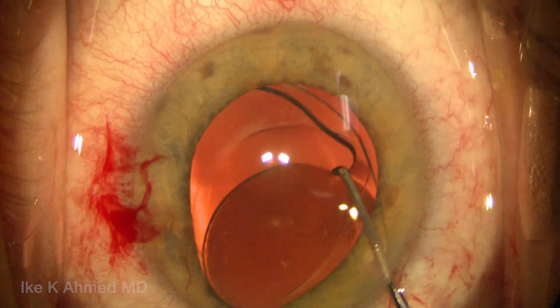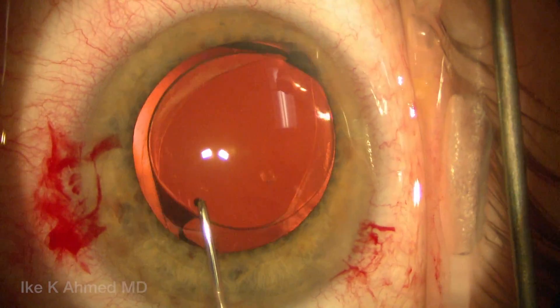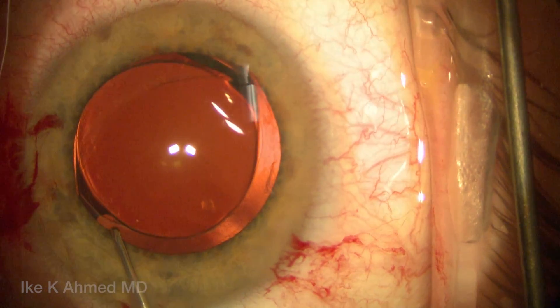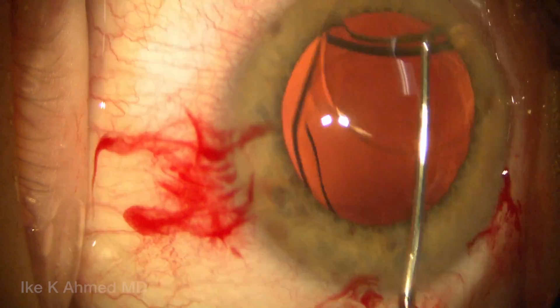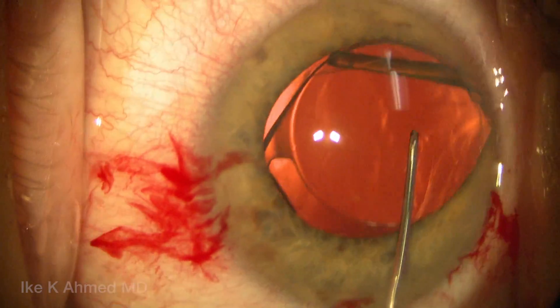We now use the Sinskey — the haptic is freed up quite well. This patient was about two-plus years post-op with minimal capsular bag reaction. We're rotating the lens in a clockwise fashion. Be very careful to watch for the terminal bulb to ensure it has not been trapped within fibrotic tissue in the capsular equator. It isn't in this case, and therefore can be easily rotated and moved.